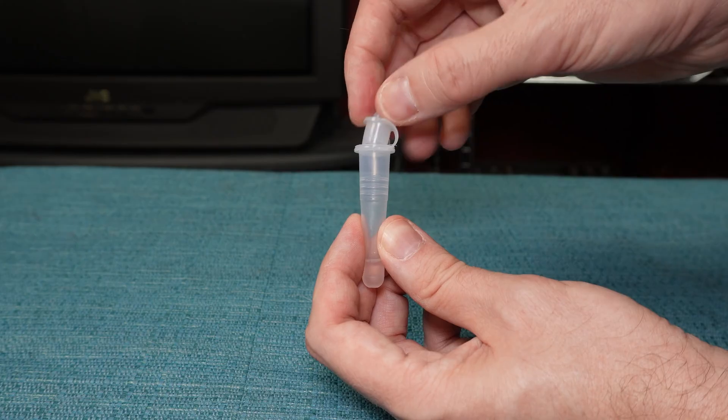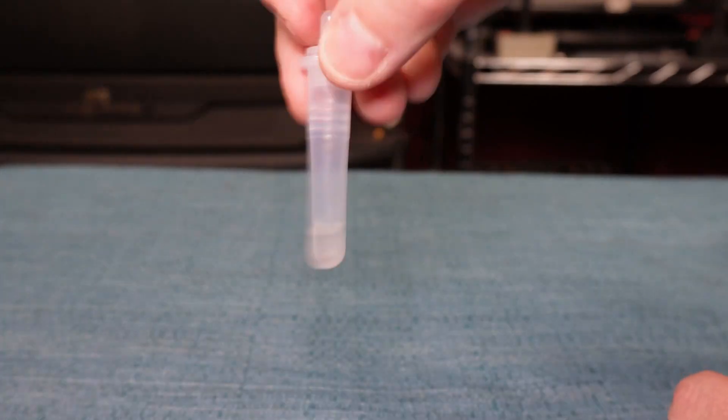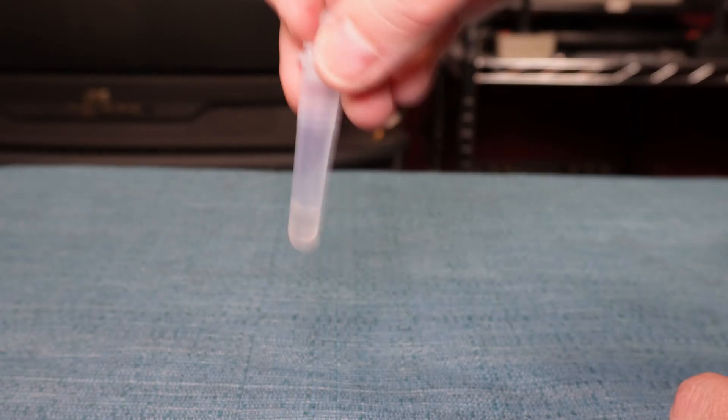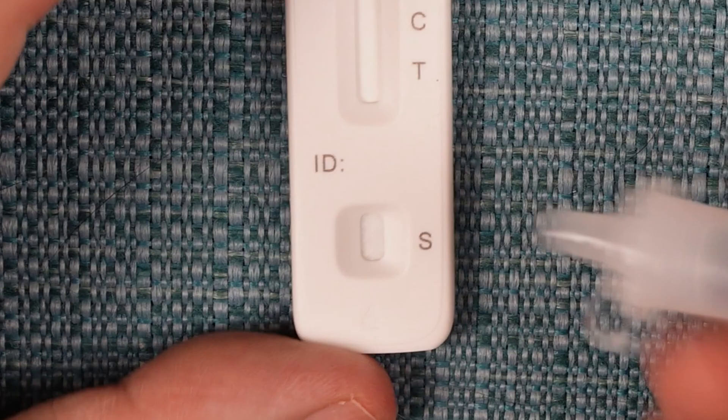Place the cap onto the tube and swirl the liquid. Then position the test cassette in front of you, turn the tube upside down, and squeeze four drops out of it into the little area marked S.